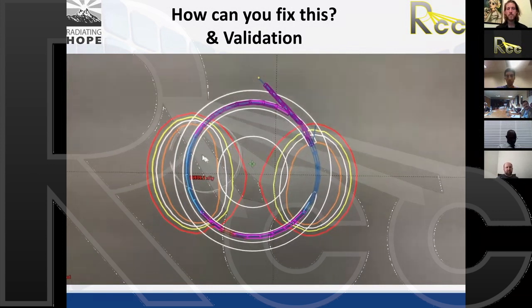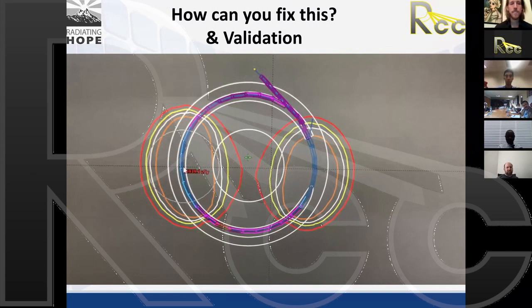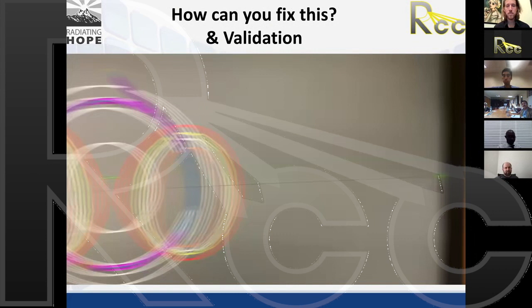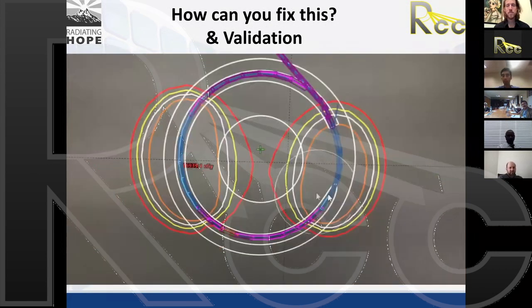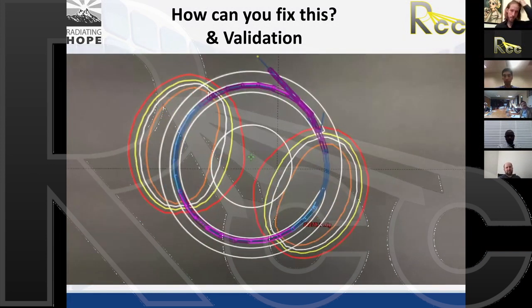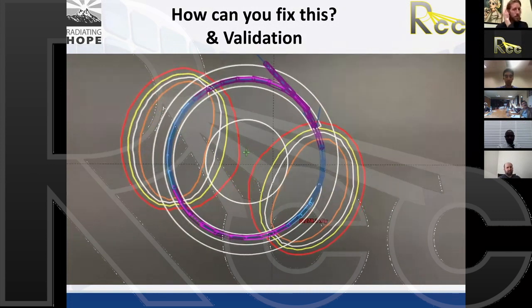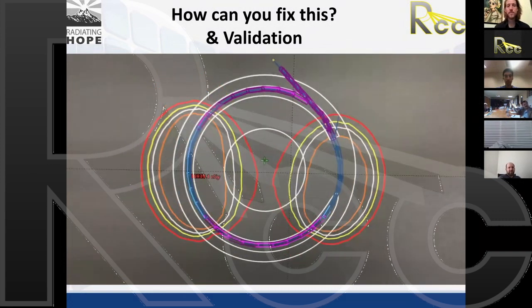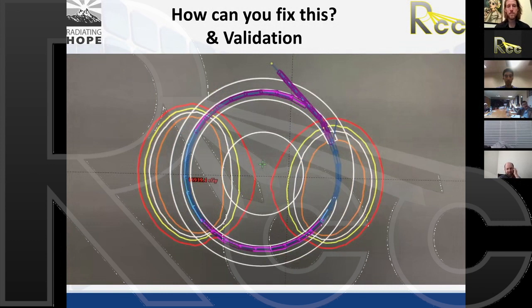So if these are my dwell positions on the patient's right or the screen's left side, then when this is actually in the patient, the isodose lines and the actual dwell positions would look like this, even though it's planned on the planning system like this, because our delivered dwell positions are shifted closer to the tip, as in the commissioning data that I showed, by 5 millimeters.